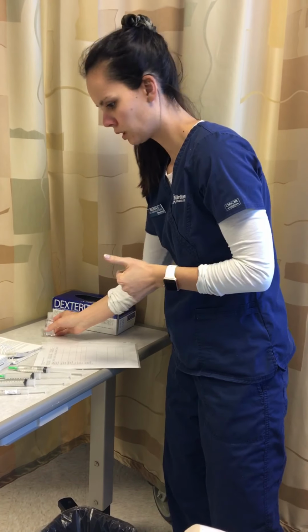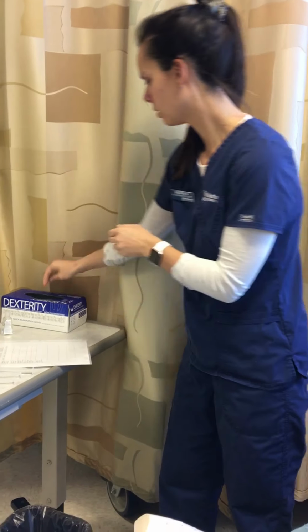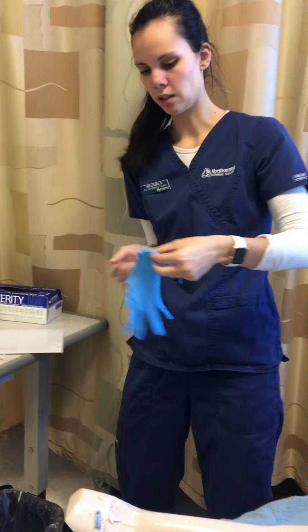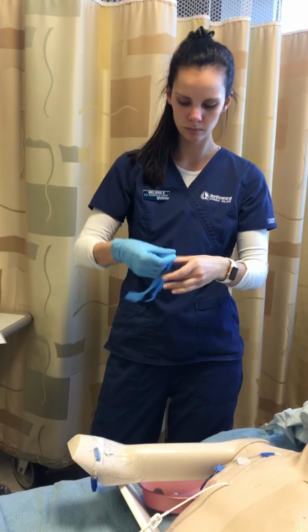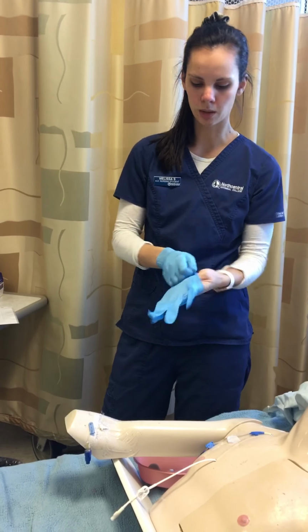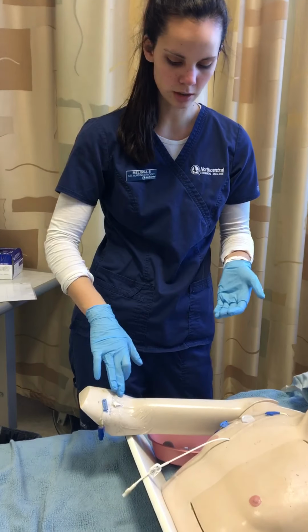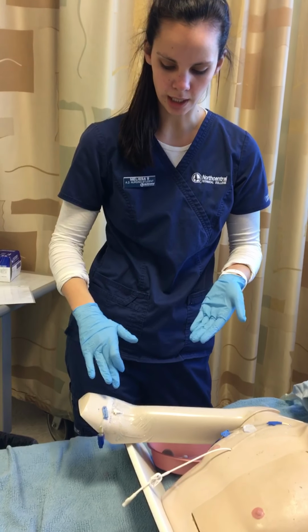Okay, so now I'm going to wash my hands. Gloves on here. And I'm going to assess the site of the PICC line. There's no tenderness, swelling, or redness, so it looks okay.